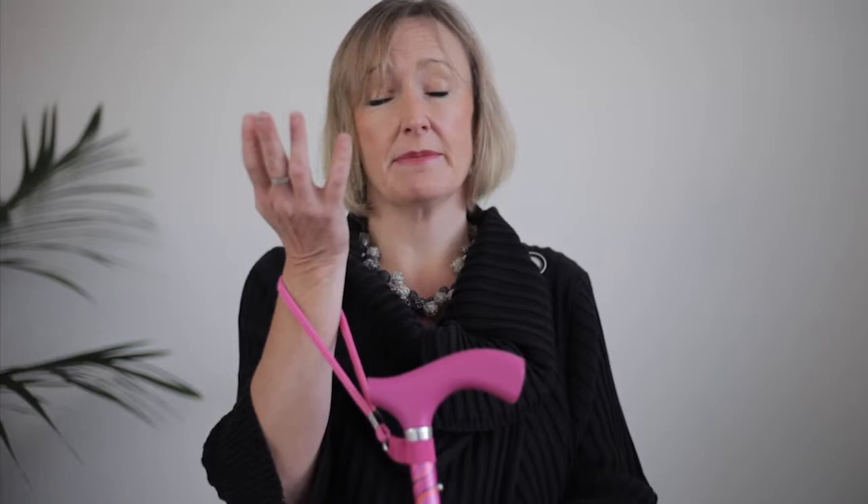Switch sticks all come with a wrist strap. Why do we do that? We think it's really useful for you to be able to pop the wrist strap on. So if you're answering the phone, paying for something, you can simply let go of your walking stick and you have your hands free. And it's great obviously if you're shopping as well.